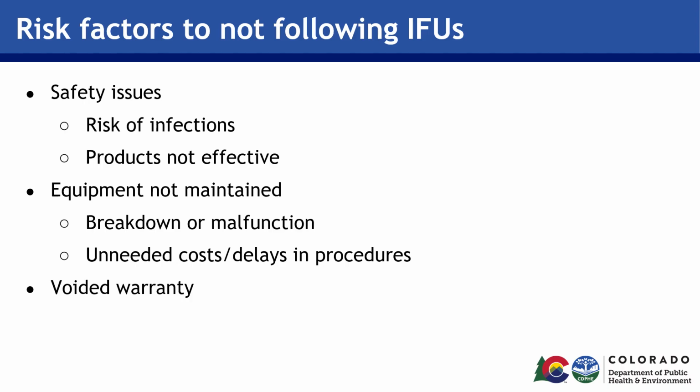Next, equipment breaking down or malfunctioning is another problem that can occur when not maintaining it per instructions. Some cleaning products may not be the right one to clean a specific medical device or equipment, as it can be too abrasive, which can wear materials down more quickly and render them unusable and needing replacement. Or maybe a metal or wired brush was used to clean a surgical instrument that has now scratched that tool, making it more susceptible to catching bioburden and not being able to clean it properly anymore.